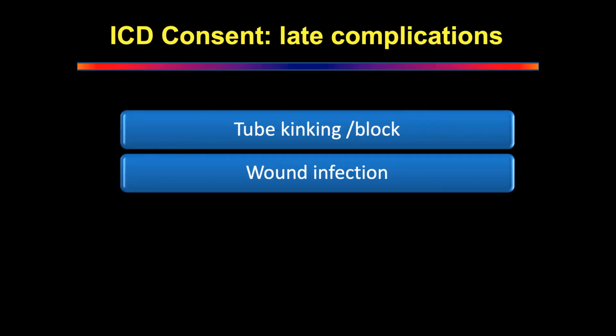The drain is in the chest wall for a long time. What can happen? Subcutaneous emphysema. Rupture. Sorry? You keep talking, Kriti. Don't listen to anybody else. You just keep trying to think. What else can happen if the chest drain is in the chest wall for a long time? After infection, what else can happen?